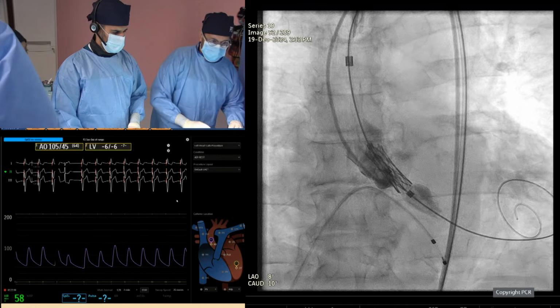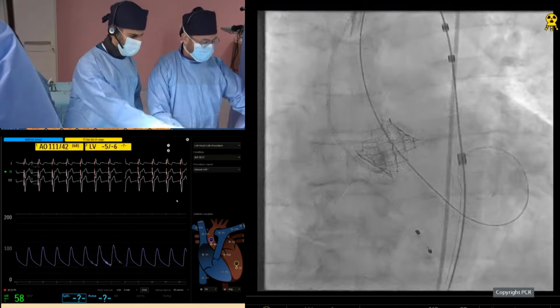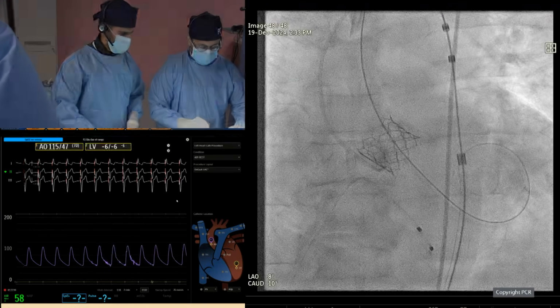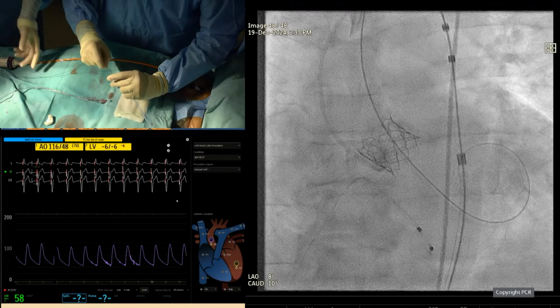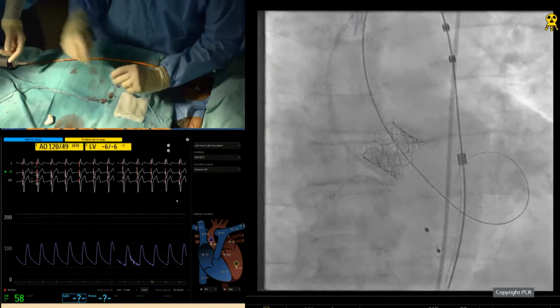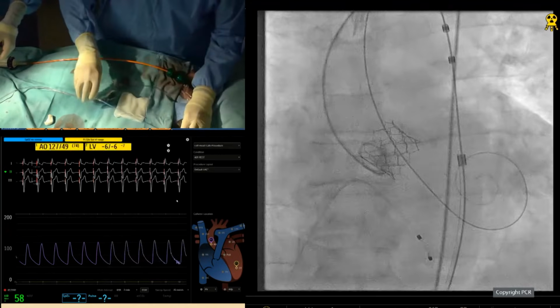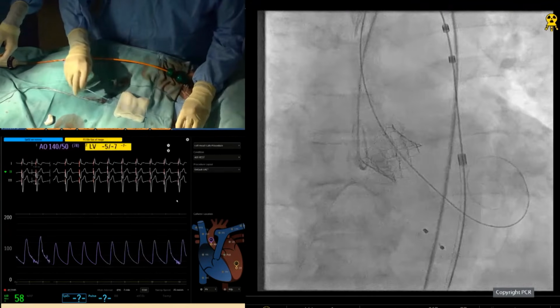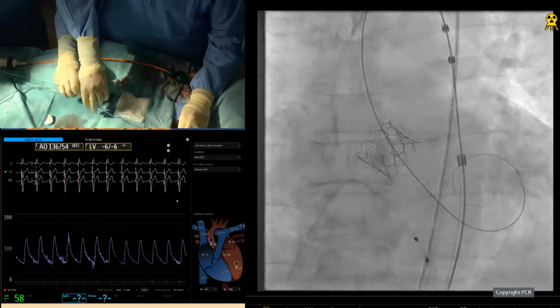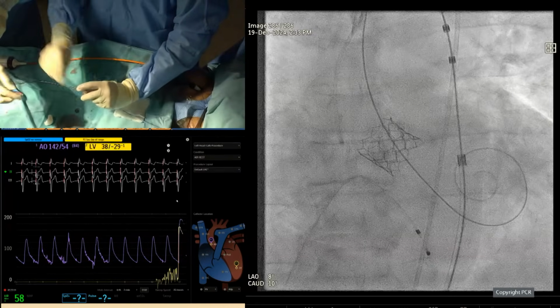Okay. It's time for us to do some hemodynamic studies. Shall we take the pigtail from there? Correct. There's one aspect, while you're going to do all that, is also go back to your aortogram when you place this valve. That's going to be interesting for us to understand and talk a bit more about. We didn't want to disturb you at that time, but it's always very educational to review that while you were positioning it.